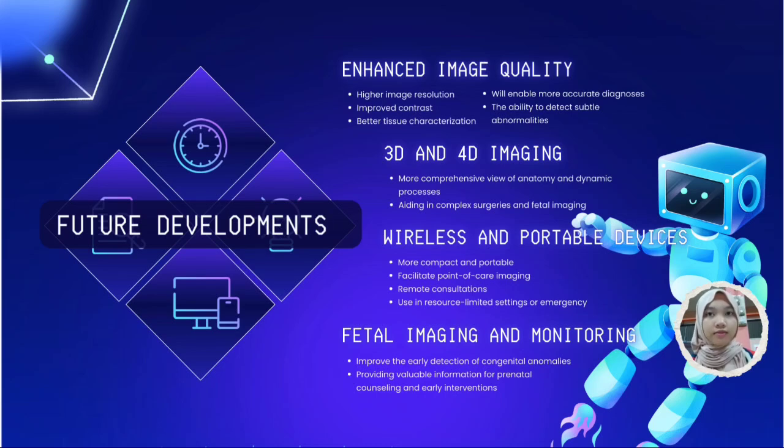Also, we have wireless and portable devices. Advancement in miniaturization and wireless connectivity will lead to the development of more compact and portable ultrasound devices. This will facilitate point-of-care imaging, remote consultation, and use in resource-limited settings or emergency situations.